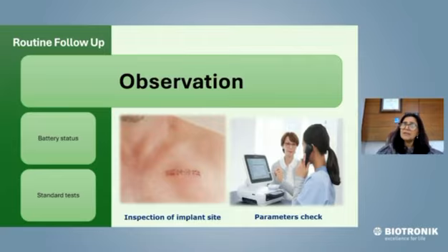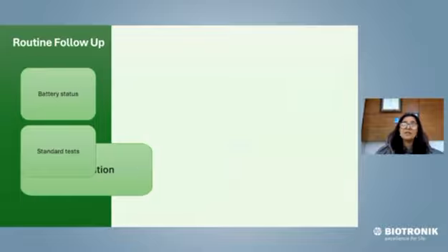When a patient comes on routine follow-up, make it a habit to look at the patient's implant site. You must look at the site. Sometimes you could see there is a scab. Sometimes you could see that there is some redness. You could, in fact, see an impending exposure of the device. First is the inspection of the implant site, and subsequent to that you go and check all the parameters.